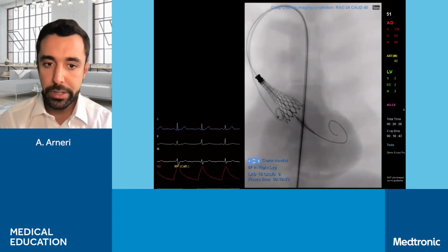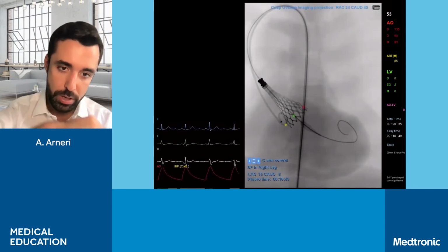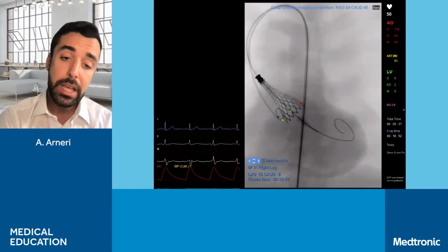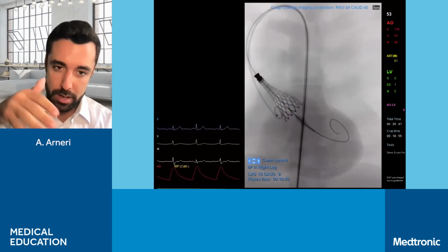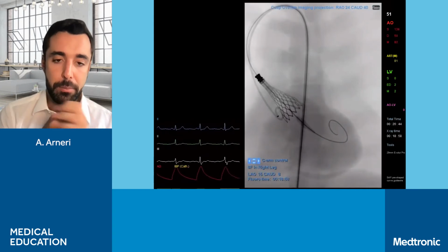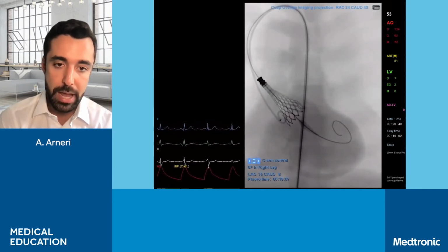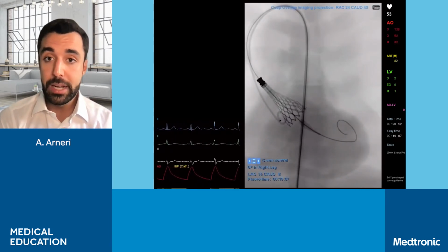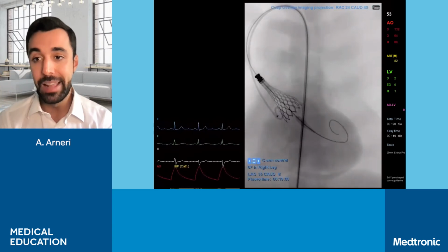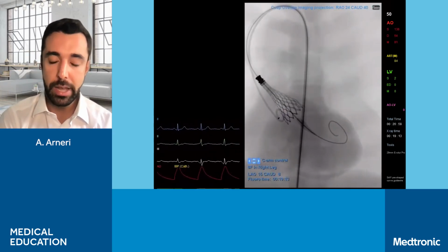Okay, and at this point, maybe we can put the 3 dots just to show if we're really in the 3. Okay, you see we are in the traditional one, the 3 dots are aligned. If at this point we don't have any parallax, meaning that the bottom part of the valve is overlapping nicely, like you see now, we don't have to do anything else. If you have still some parallax at this point, you just need to add some LAO till you don't have any more parallax. But in this case, it's okay already.